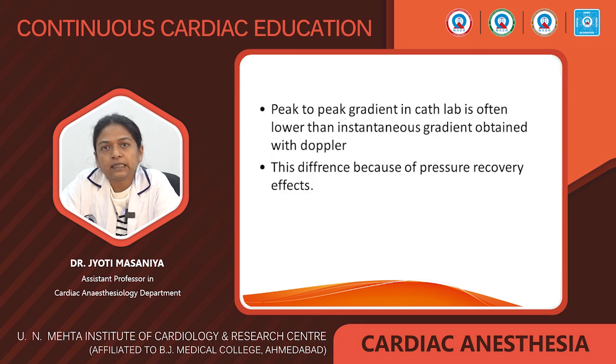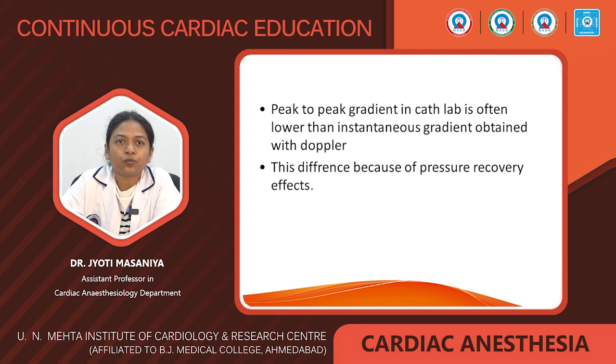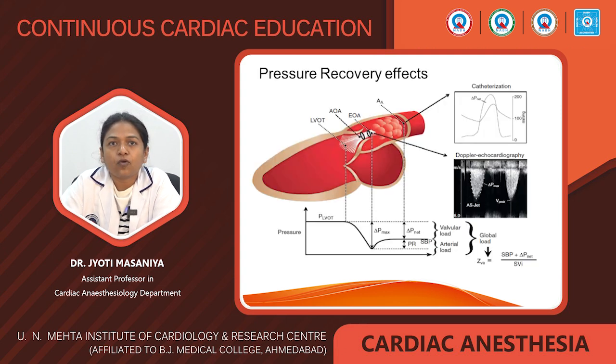Peak to peak gradient in the cath lab is often lower than the instantaneous gradient obtained with Doppler, and this difference is because of the pressure recovery effect. Now, what is the pressure recovery effect? When blood flows through the stenotic orifice, the potential energy will be converted into kinetic energy. You can see in this figure, when the blood flow passes through the stenotic orifice, the pressure will drop.